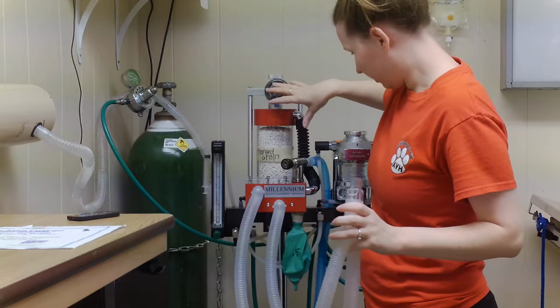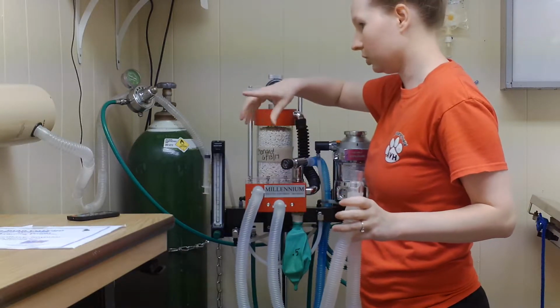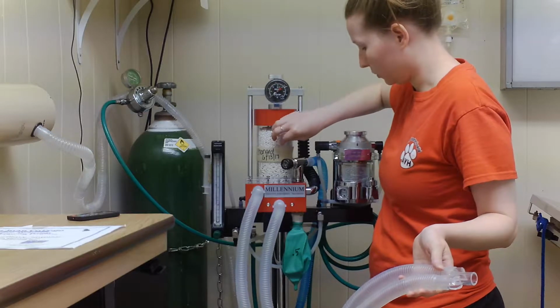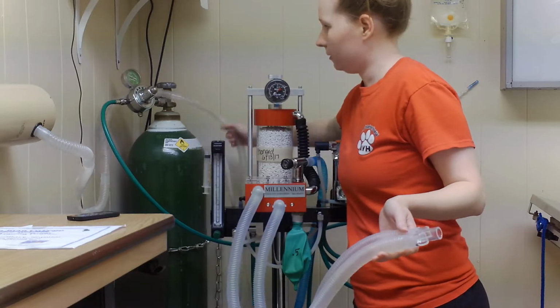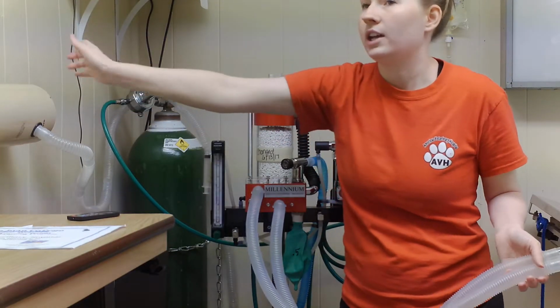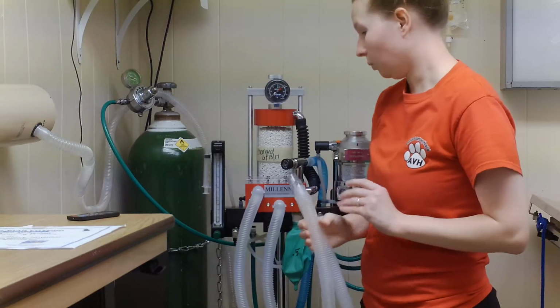As all of this is exiting, obviously, there's also the scavenging system, which handles the waste anesthetic gas that the patient puts out, that the soda does not absorb. The waste anesthetic gas will come through this little hose, which we have connected to our scavenging system, which turns on just like a little vacuum, essentially, and that has a pipe that goes out through our ceiling to the outside. That way we're not breathing in any waste gas.